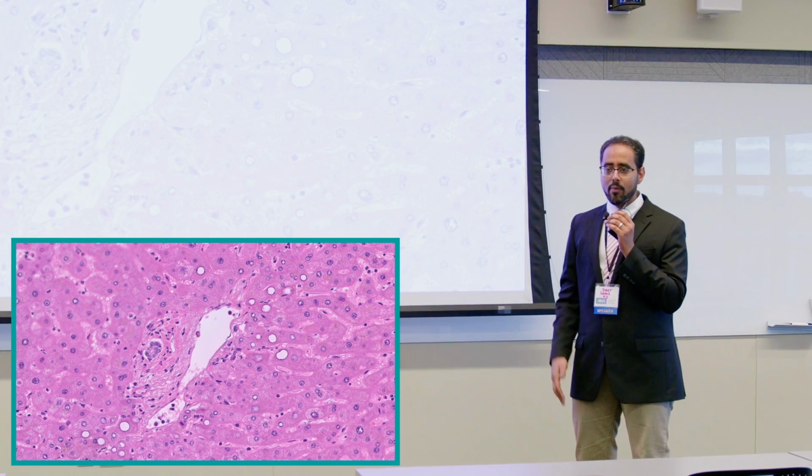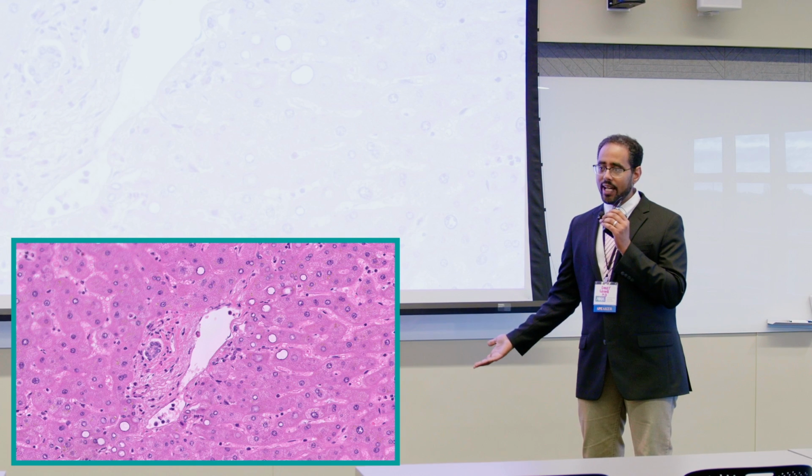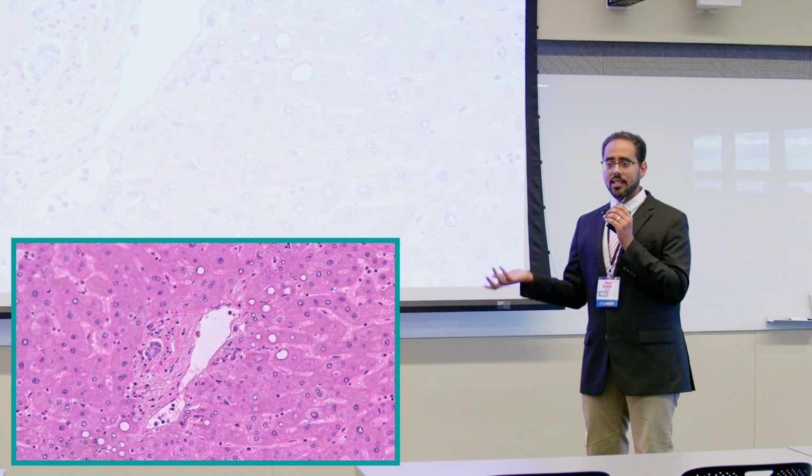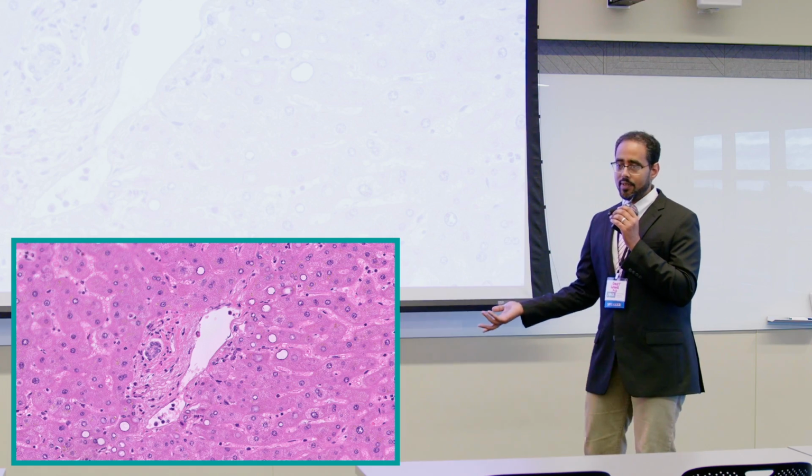And then when autoimmune hepatitis happens, what's it going to look like? It's what I showed you in the cartoon: the immune cells that are supposed to be protecting the liver come and attack the liver. So I'm going to show you that.